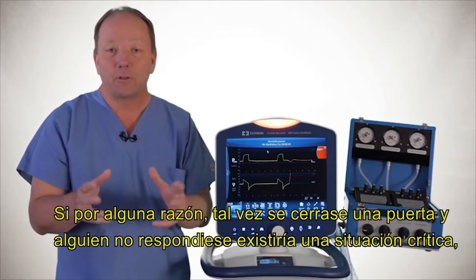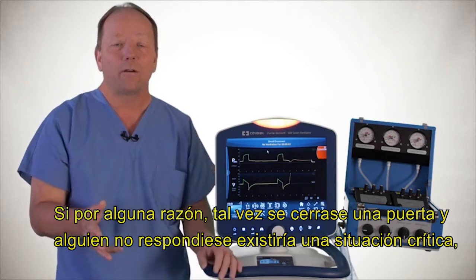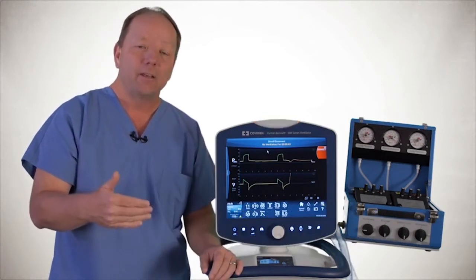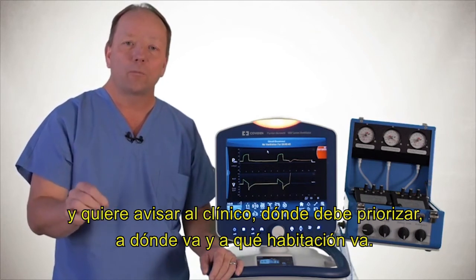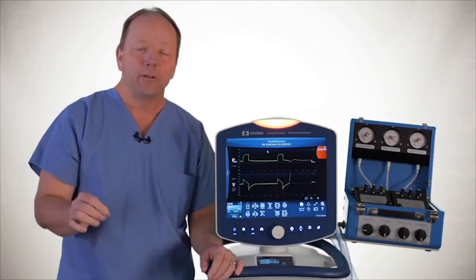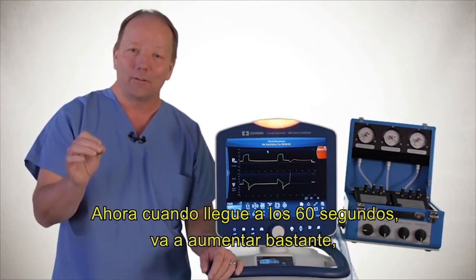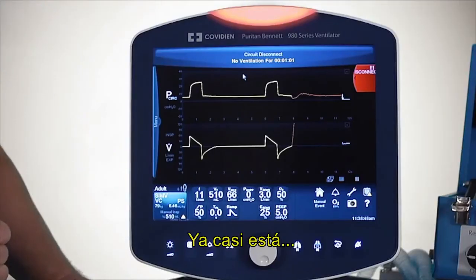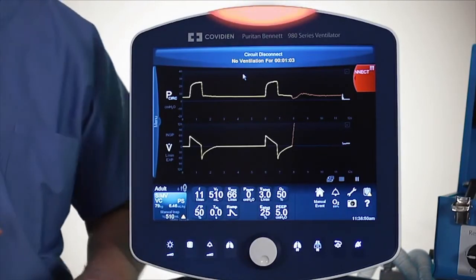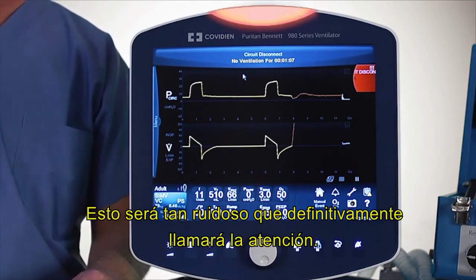So if for some reason maybe a door was closed and someone was not responding, you have a critical situation where this patient is actually disconnected, and it wants to let the clinician know where should I prioritize where I'm going and to which room I'm going into. Now when it hits 60 seconds, it's really going to increase quite a bit, which once again will signal to the caregiver, I need to get into that room. So I'm about there, and that's loud. That'll definitely get your attention.